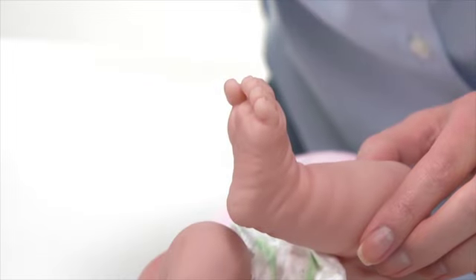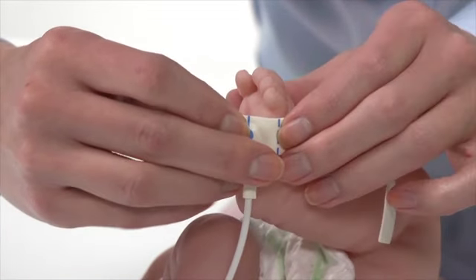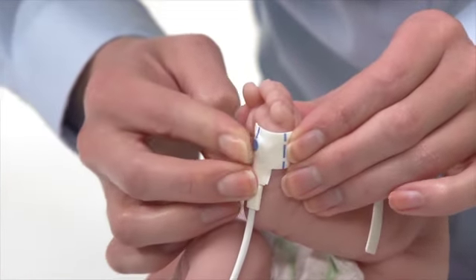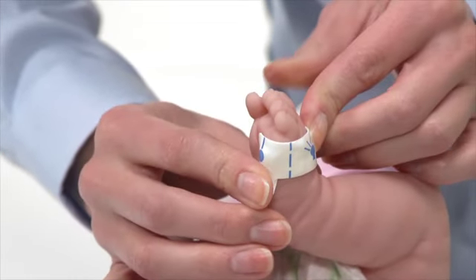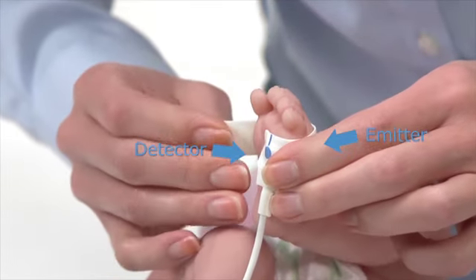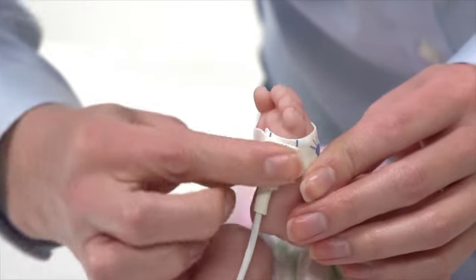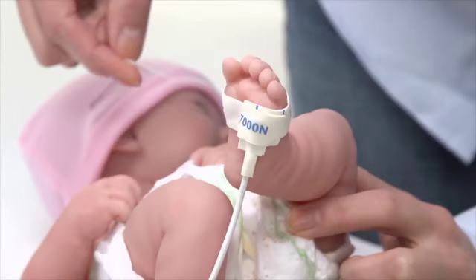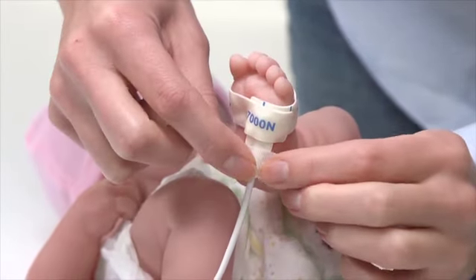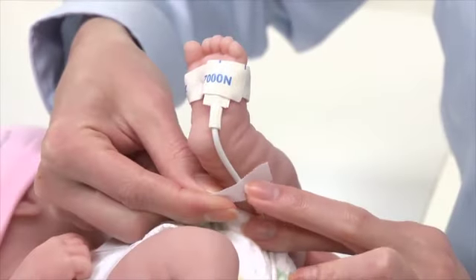For placement on the foot of a neonate 4 or less pounds in weight, place the cable portion on the bottom center of the foot at the base of the toes, with the cable running back toward the heel. Now, wrap the sensor on top of the foot, aligning the top portion with the sensor portion on the bottom of the foot. It's a good idea to gently secure the sensor cable independently from the sensor along the bottom of the foot or at the ankle, depending on the foot size.